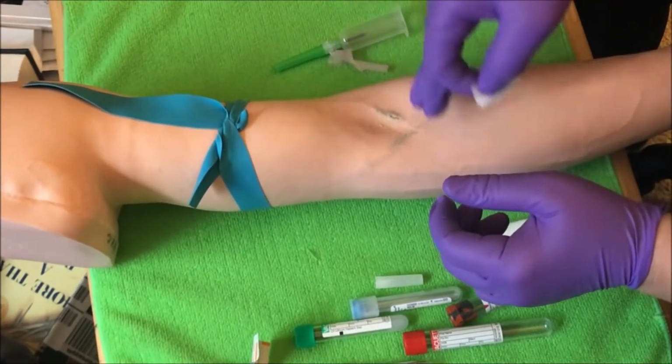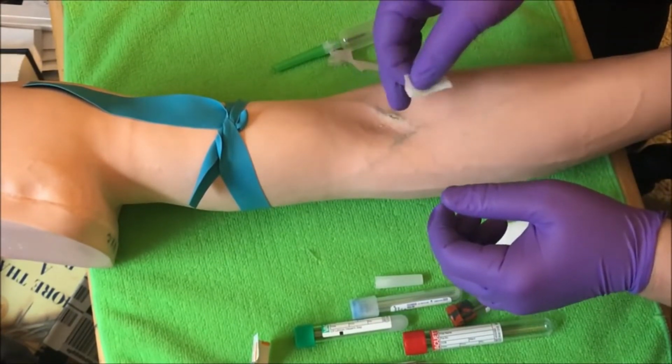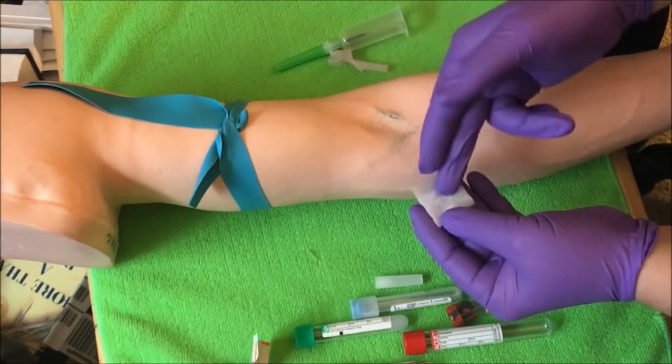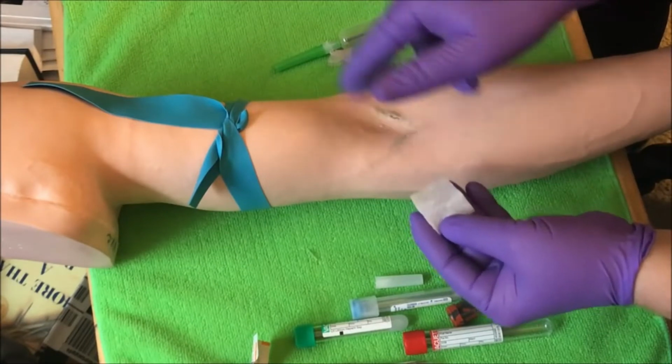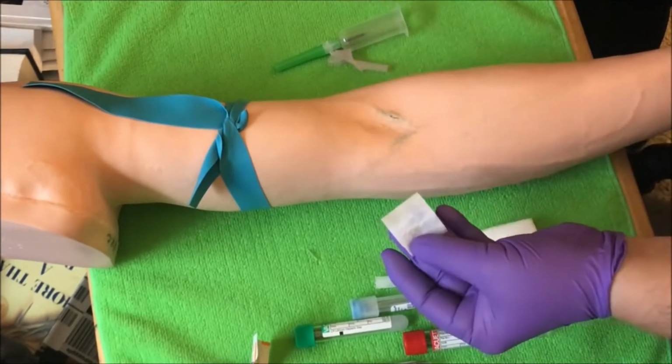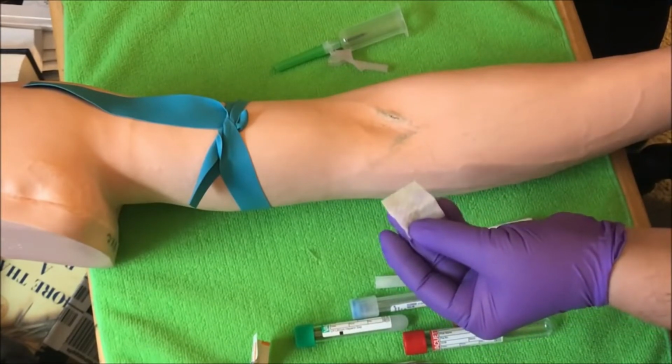And all you're doing is just circling over the site. That's not cleaning the site. All you're doing is taking whatever is on the arm and on the alcohol pad collected and just going in a circle and just redistributing whatever's on here. That's not cleaning the site.